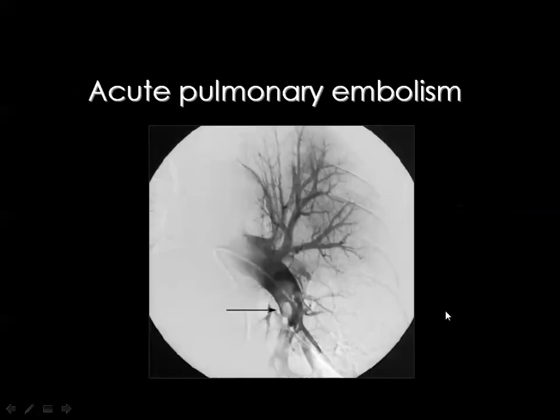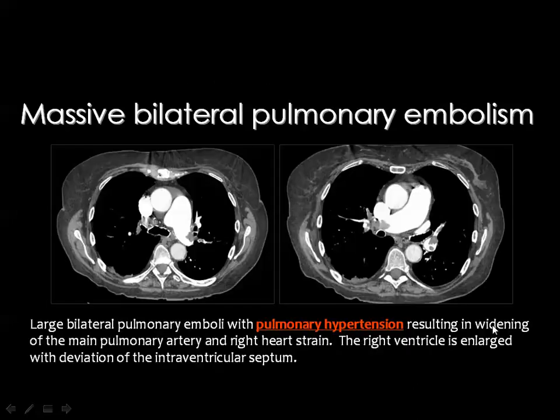Pulmonary embolism was also diagnosed by selective conventional or DSA aided pulmonary angiogram, and this is the catheter introduced into the left lower lobe pulmonary artery branch, showing multiple filling defects within the artery with non-filling of the peripheral vessels.